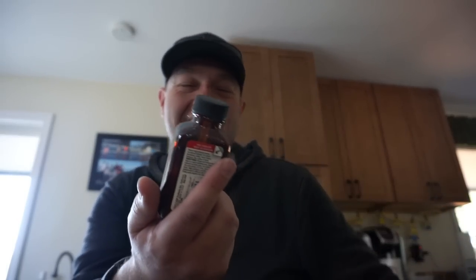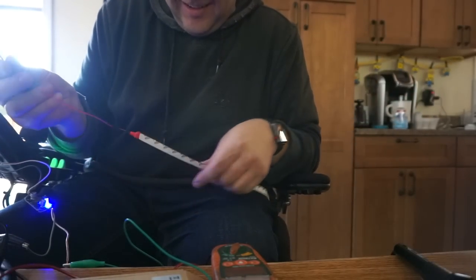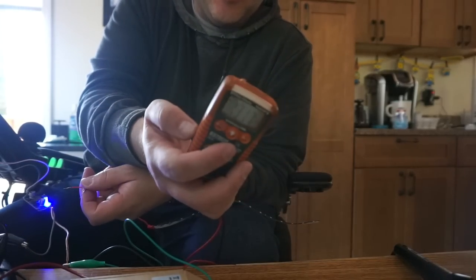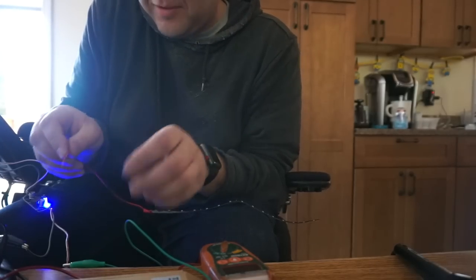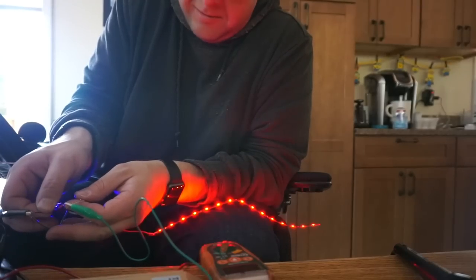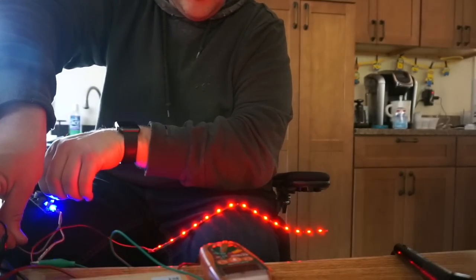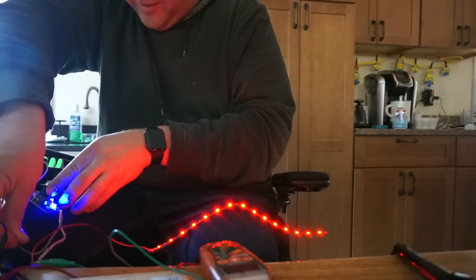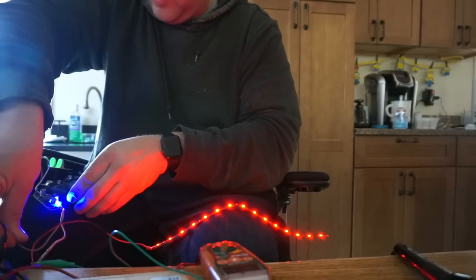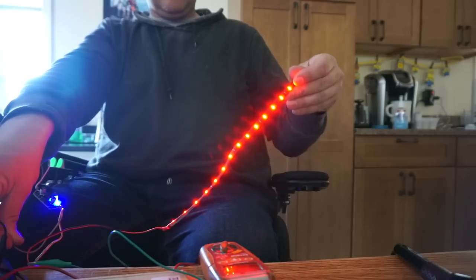Smells like glue in here — I forgot I had contact cement in this box. Got some of these little LED strips; we're going to power them up and see if they're very bright. I've jammed this power converter into the joystick on my chair and tuned it to about 13 volts, which is the safest thing I can think of. They're not the brightest things in the world, but it's definitely some light. Let's crank up the voltage a little bit — if anything can handle 12, it can handle 14. Once you get above that it's a little questionable. At 13.8 and then 14.1 it's making a difference — that's visible at night.